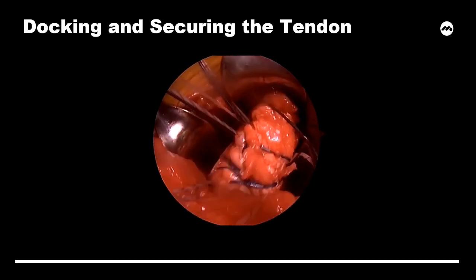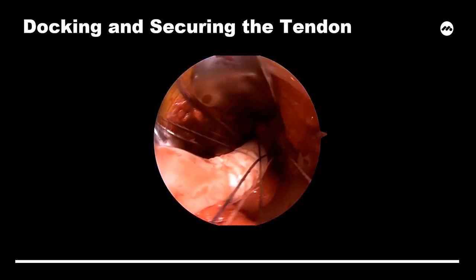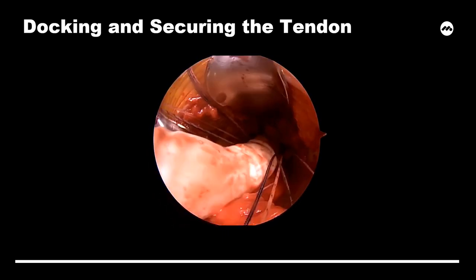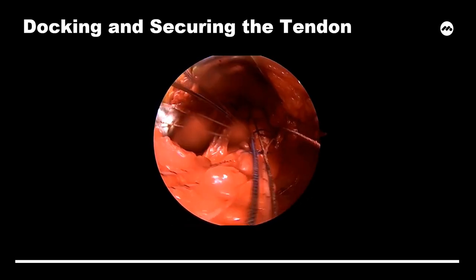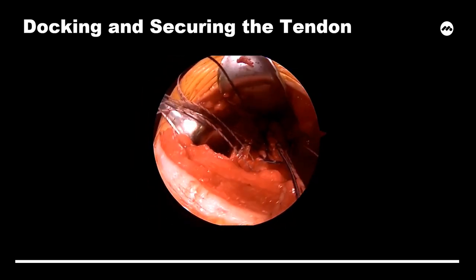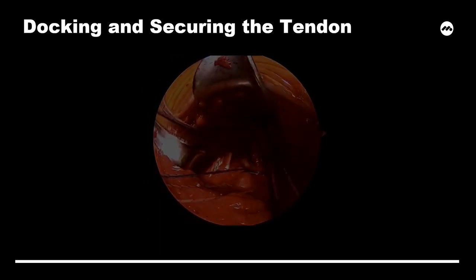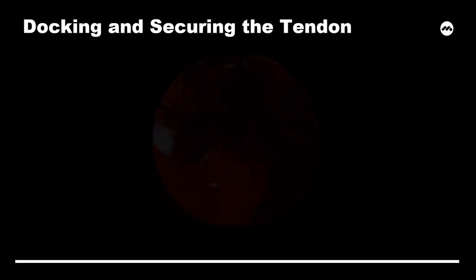The tendon is then reduced to the ischial tuberosity utilizing a docking technique. Tension is pulled on each of the post strands to bring the tendon down to the bone and anchors. Tension should be maintained on the remaining posts as sutures are then tied sequentially.